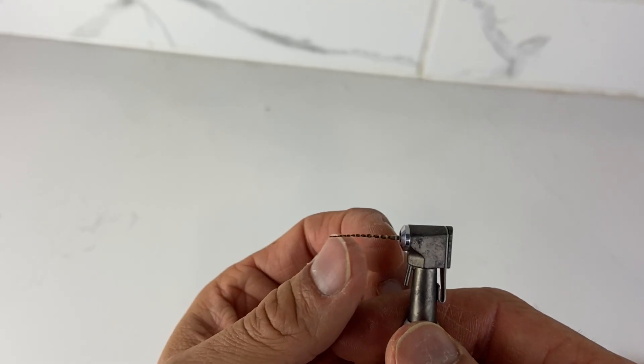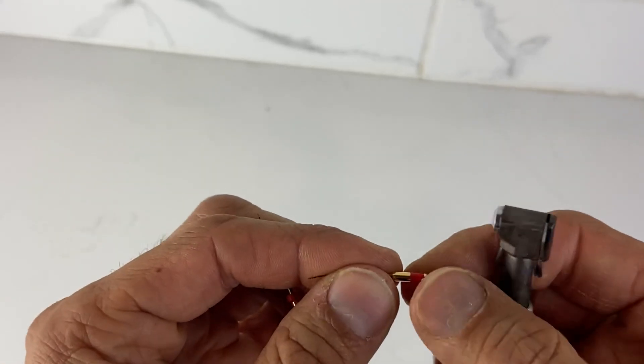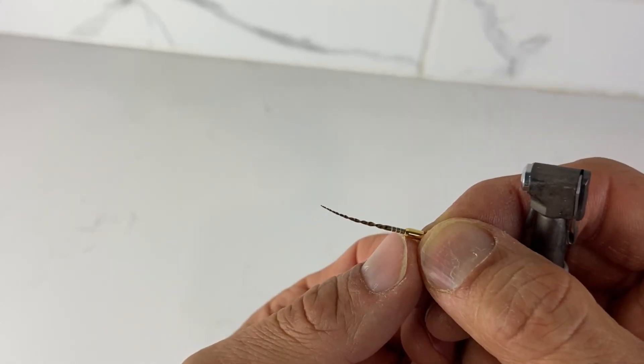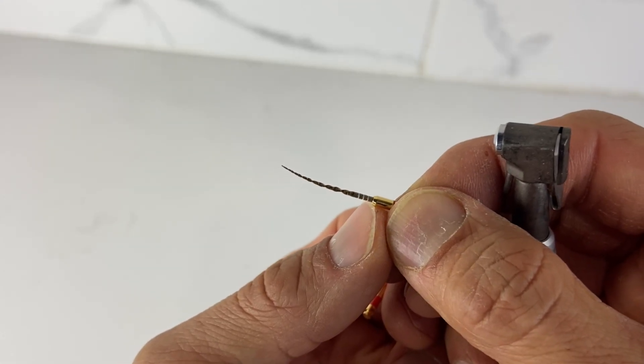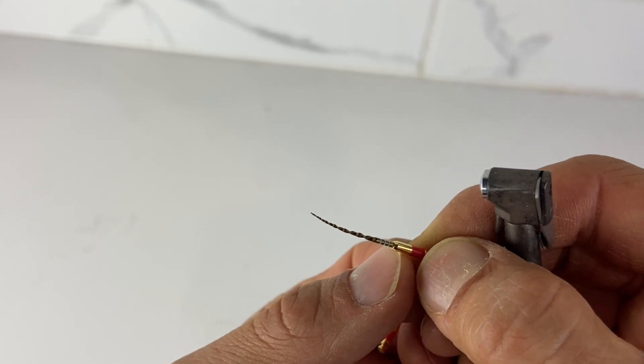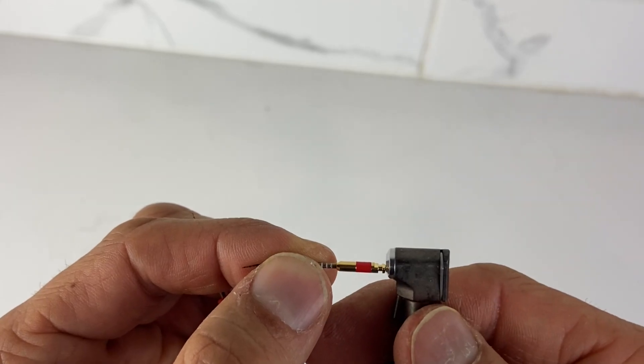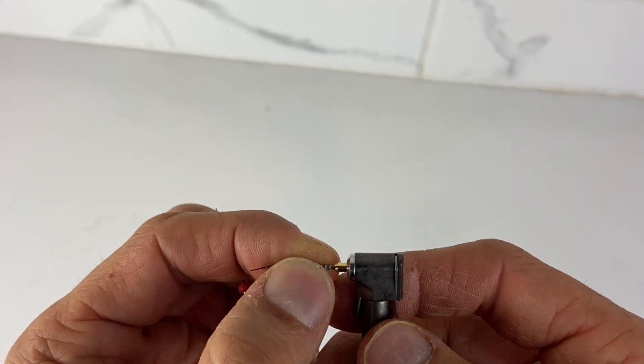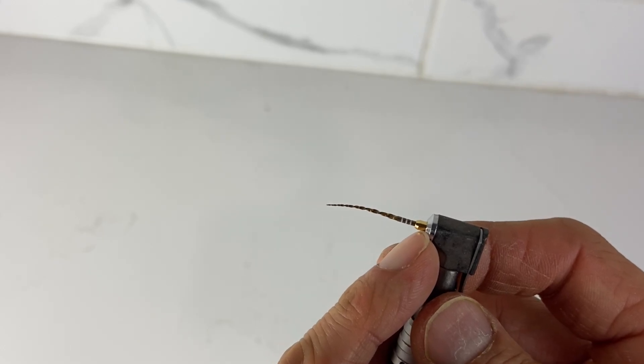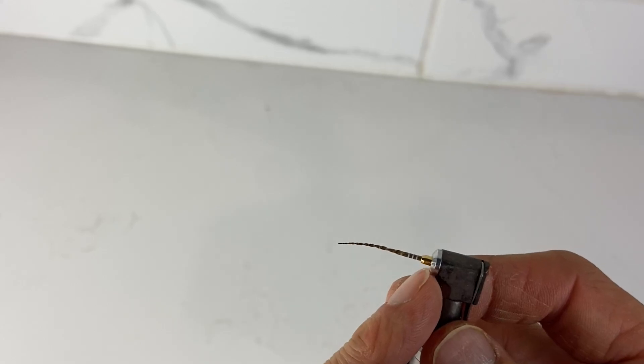What I have done before is I will measure from the hub and I will sink it to the hub. There've been times in different clinics we didn't actually have the right length of file. We didn't have 21.5 millimeters. So I got to sink it to the hub and beyond and try to make it work. And sometimes I was hand filing with this thing. The one I was using allowed me to expose that amount that I was able to use. So I didn't have to switch to a 25. I was able to finish my case with just this.